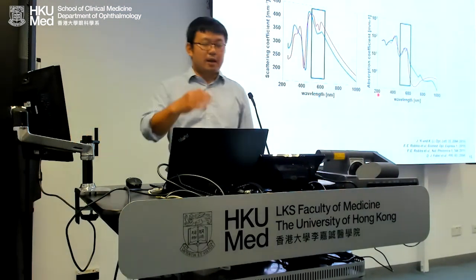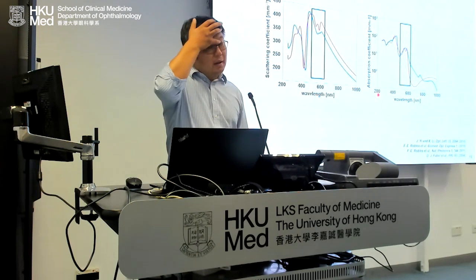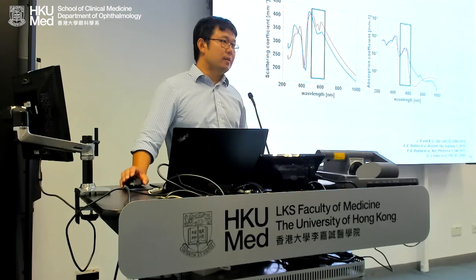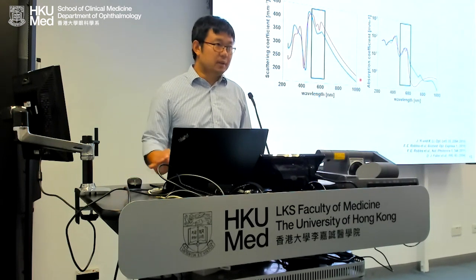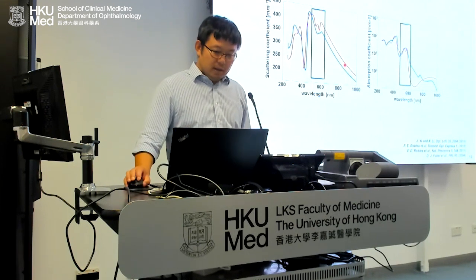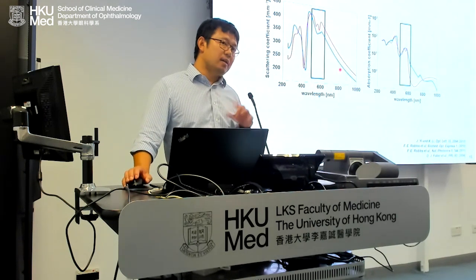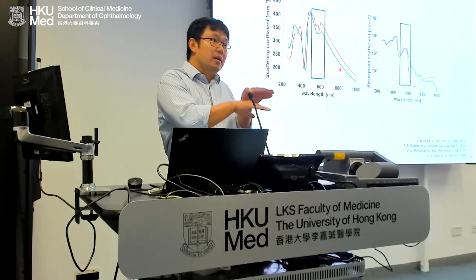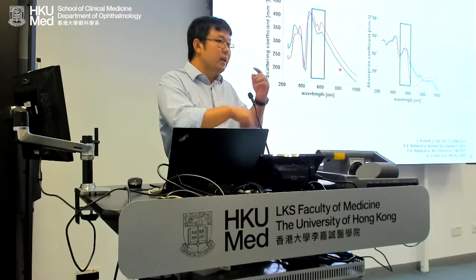So back to the optical property here. We want to measure oxygen consumption. SO2 stands for saturation of oxygen inside the blood. And that's the beauty of visible light. For a clinical machine, these two parallel lines show that for oxygenated and deoxygenated blood, there's no difference. They're in parallel lines. So mathematically, when the two features are in parallel, it's unstable to do the inverse calculation.